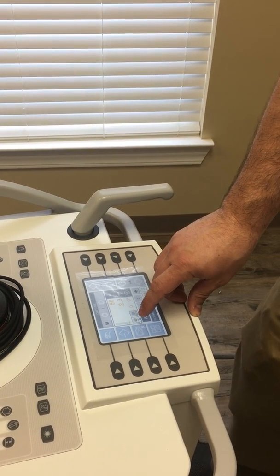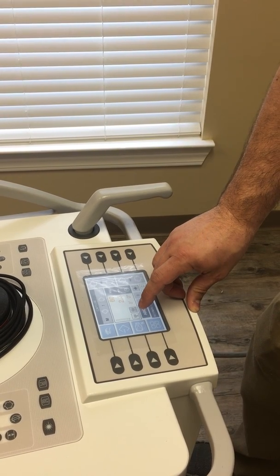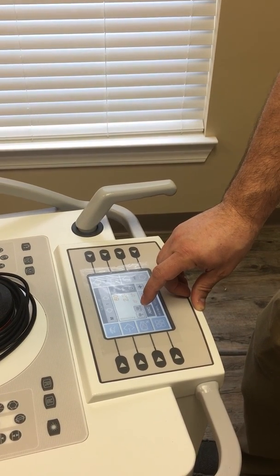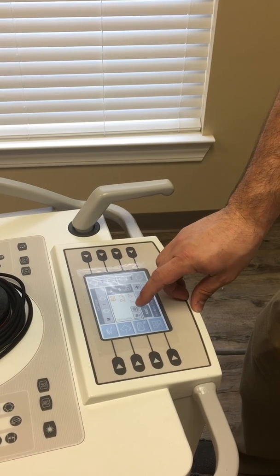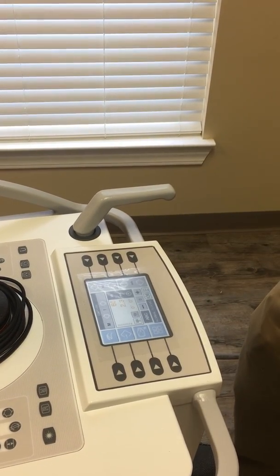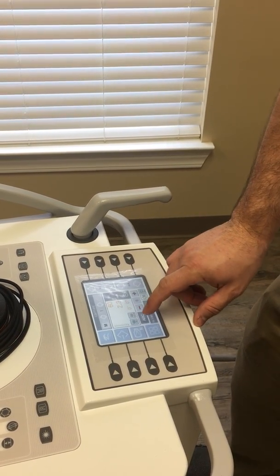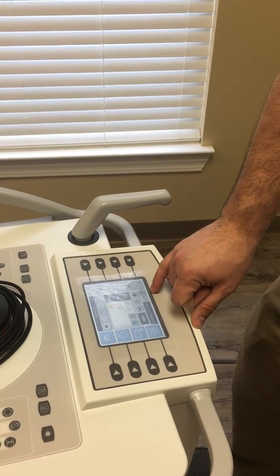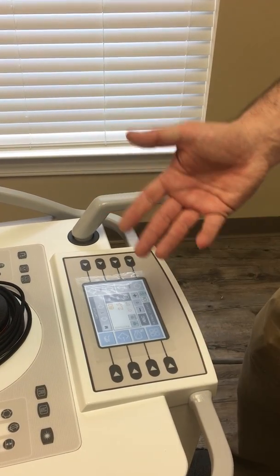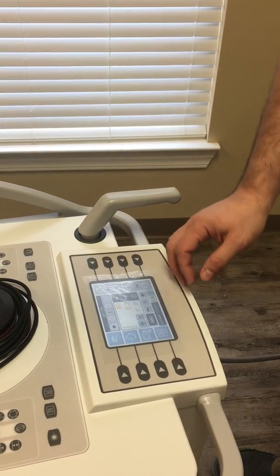I'm not sure if you guys use digital subtraction. So this you could turn on both from the touch panel and the workstation itself. Basically you just hit DSA. When DSA turns on, the Cine function turns on, so it will automatically capture. Otherwise it's kind of not doing much for you.